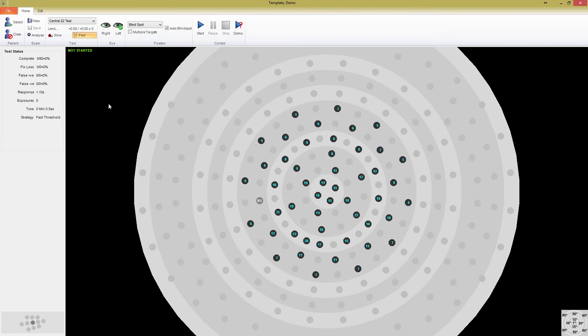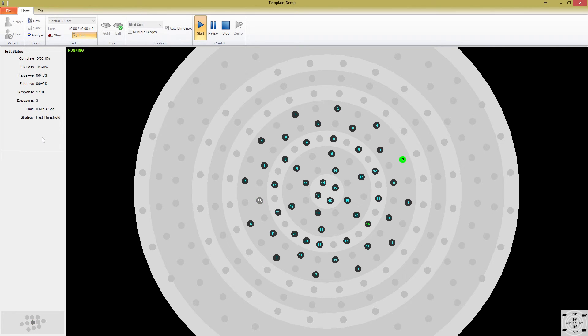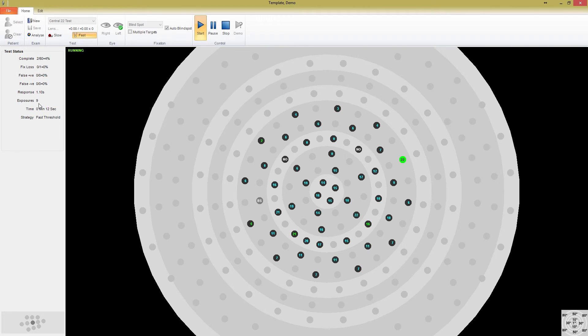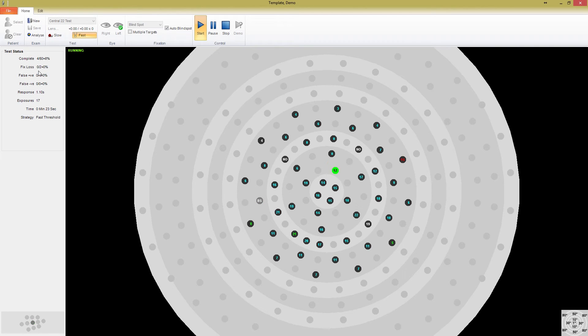If we start the test, you can watch the test status indicators update. You can see that the blind spot is checked first to ensure the patient is fixated correctly to begin with. As each point is tested, you can see the exposures number incrementing upwards. You can also see that at about every 8-12 points, the blind spot is tested, and the fixation loss status also updates. If this were a real test with video fixation, the blind spot would not be checked. You can try the simulator out on your own and watch how everything updates.